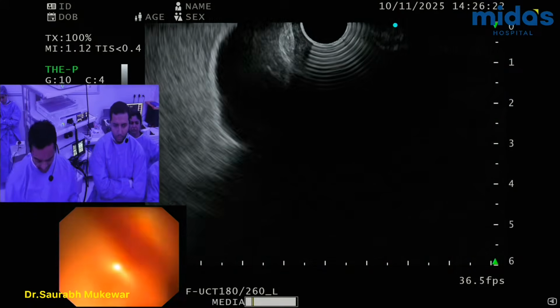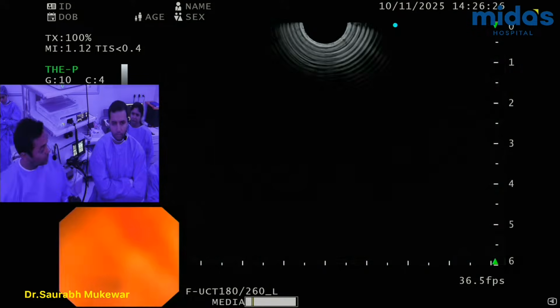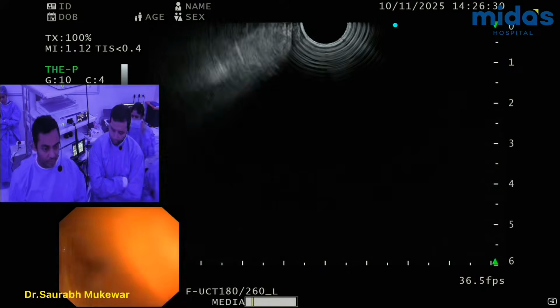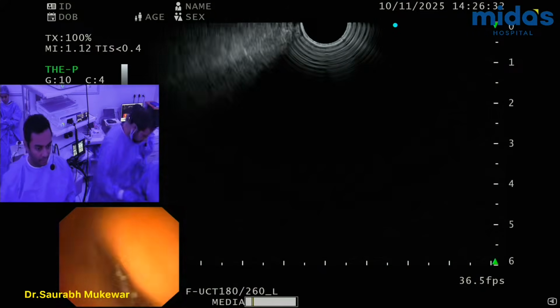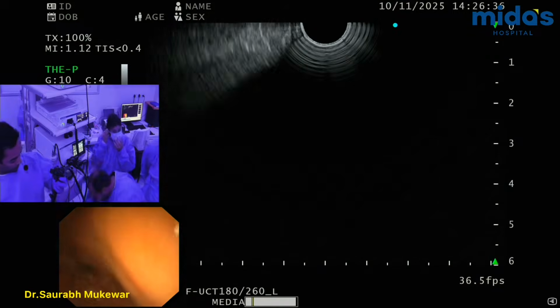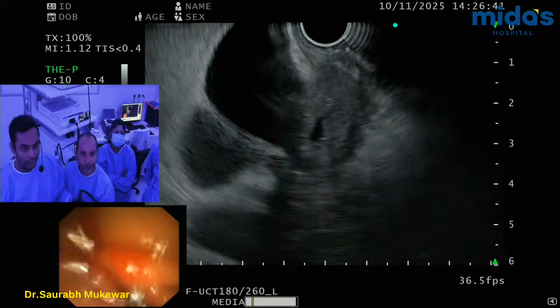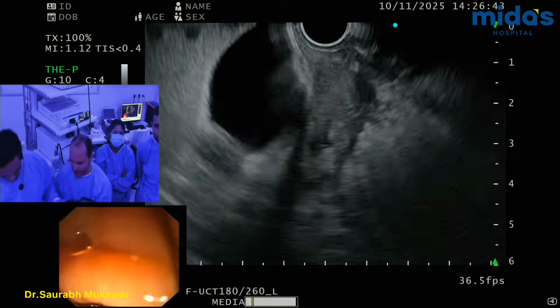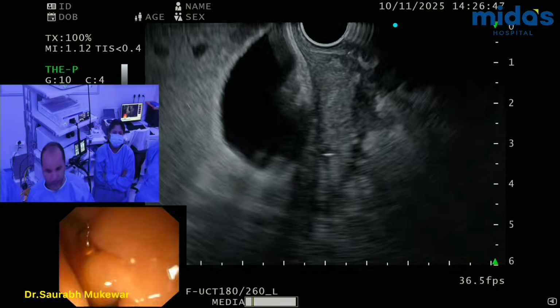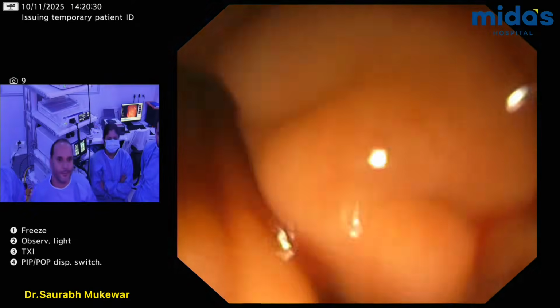All right, so you guys want to see, both of you, since you've been around for a bit. Come, take a look. Only the bulb. Go ahead. So you want to go in the bulb. Now press this button. Yes. Pull back, yes.